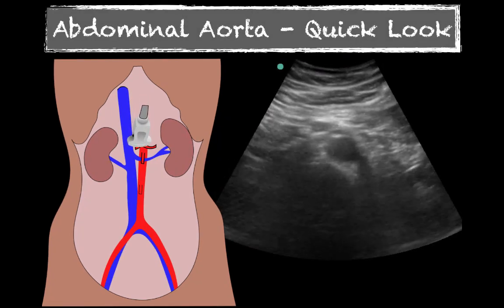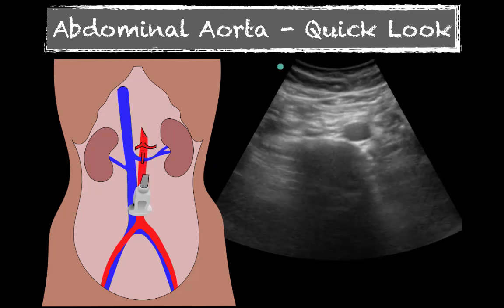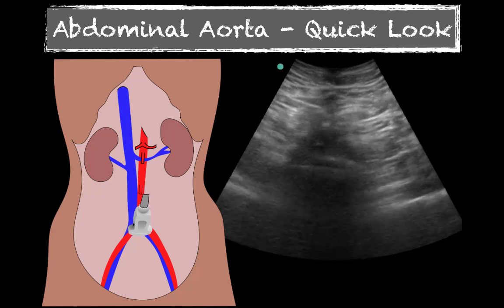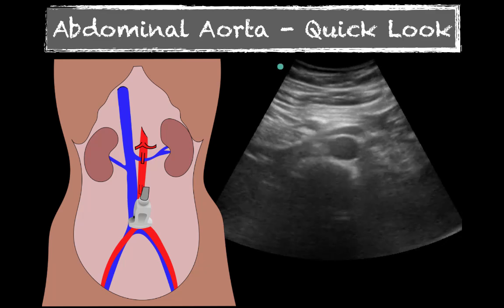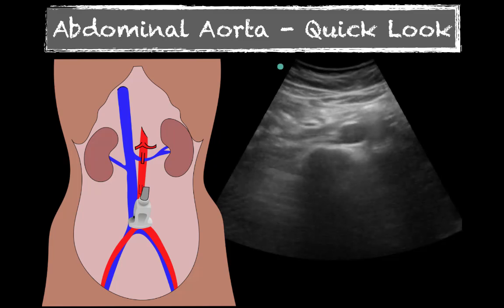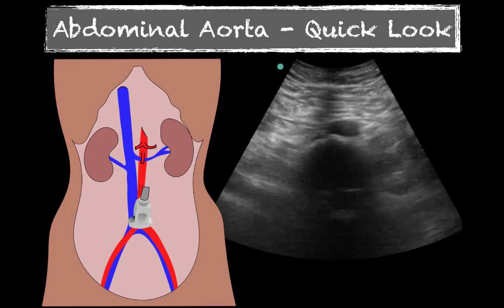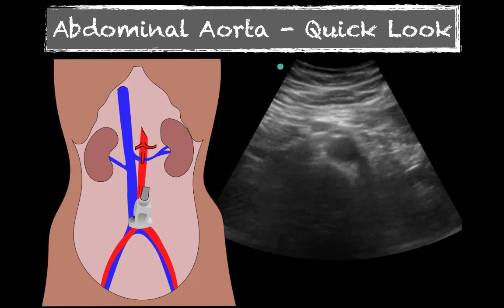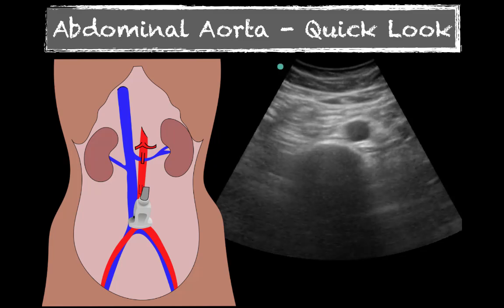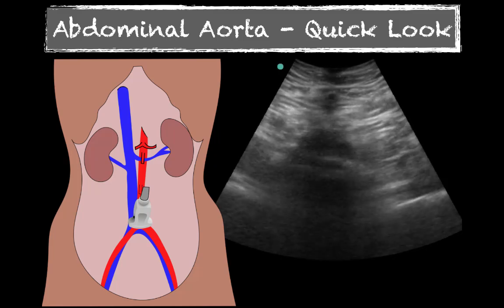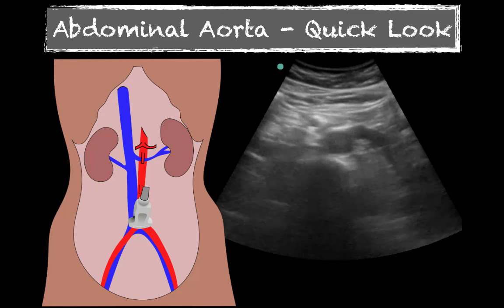I like to take what I call a quick look. I start with the probe high, right under the subxiphoid process, and drag it down to the belly button. This allows me to quickly determine if there's an aneurysm I've got to deal with. If it's a big aneurysm, I can ask a nurse or clerk to page vascular surgery while I go back and get accurate measurements. It can also remove a lot of worry — I can look and say there's no large aneurysm, then go back and get saved measurements to support my diagnosis. It's essentially a 10-second assessment of whether there's an aneurysm or not.